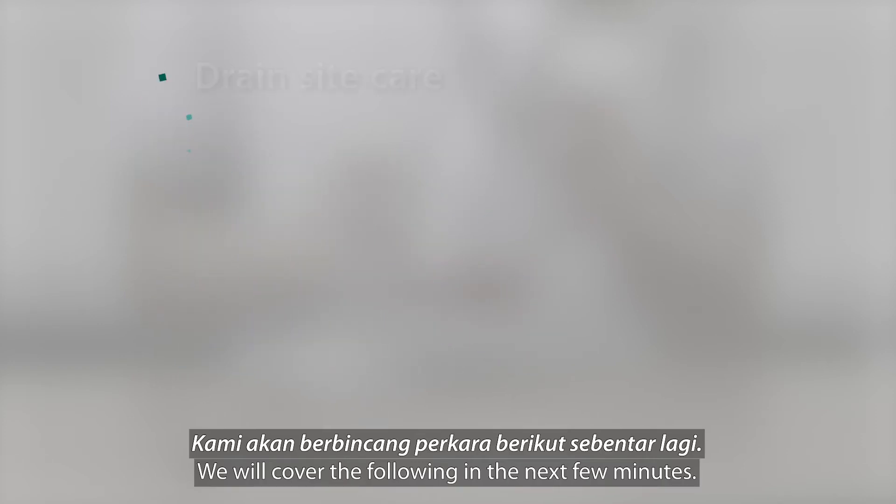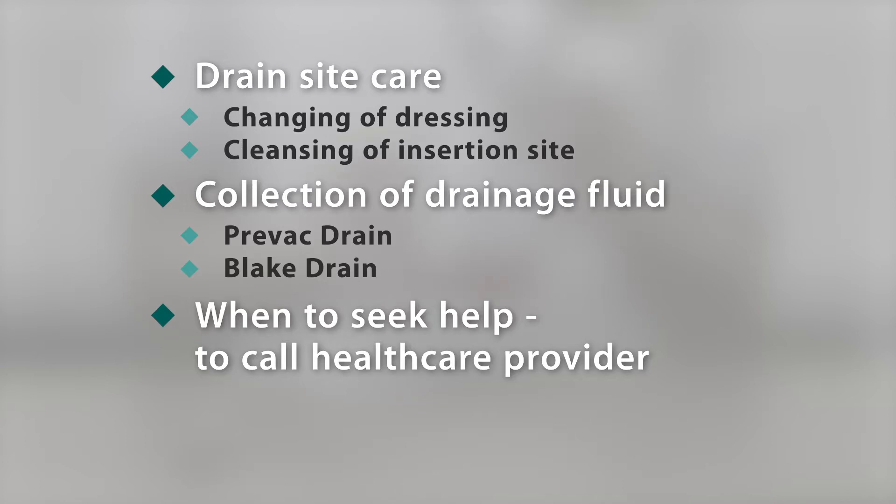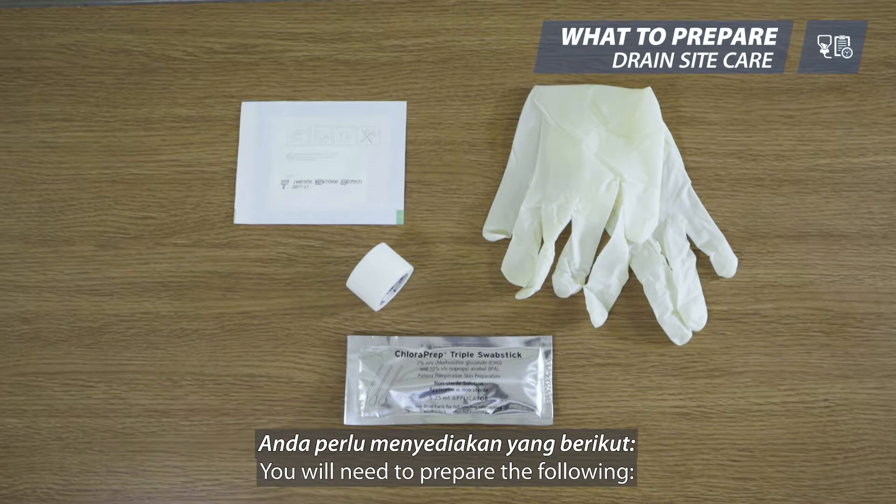We will cover the following in the next few minutes. You will need to prepare the following.